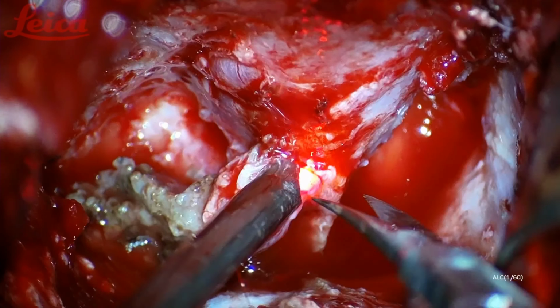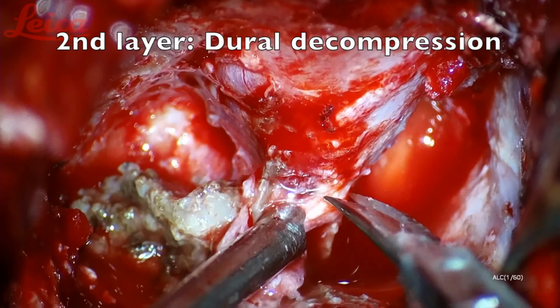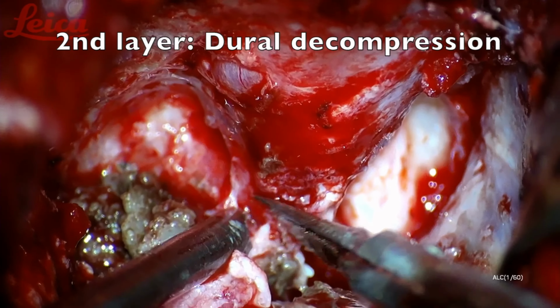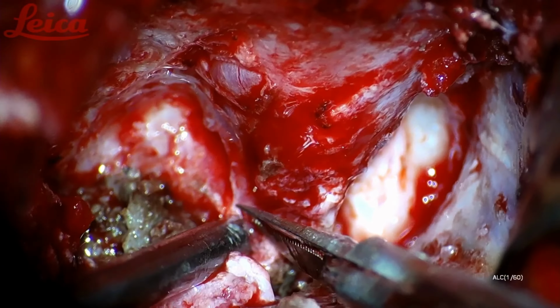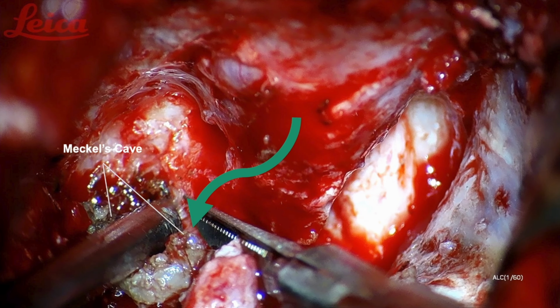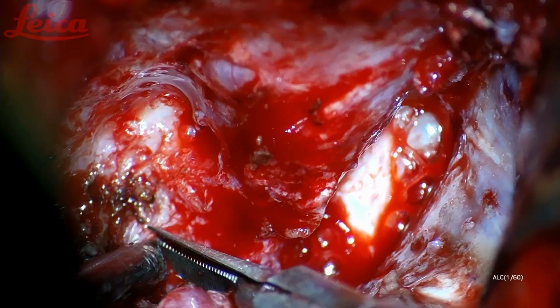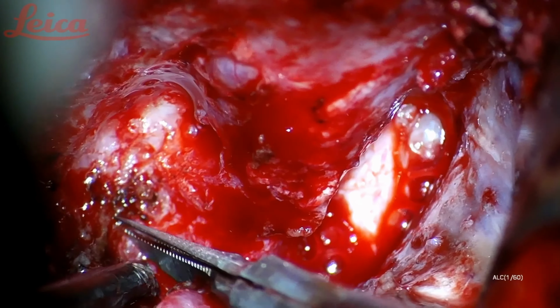Once both compartments are communicated, periosteal dural layer is incised at the level of the orbit, and tumor capsule is dissected free from the periorbita. Dissection plane is followed backward using sharp techniques in the direction of the middle cranial fossa. This constitutes the preliminary steps for the extradural decompression of the cavernous sinus and the Meckel cave.